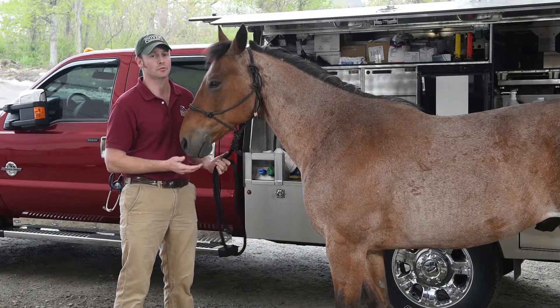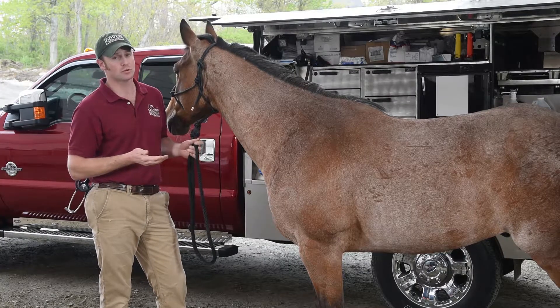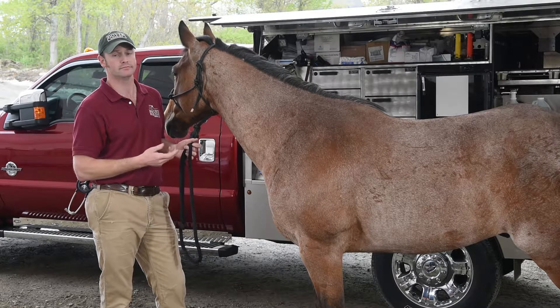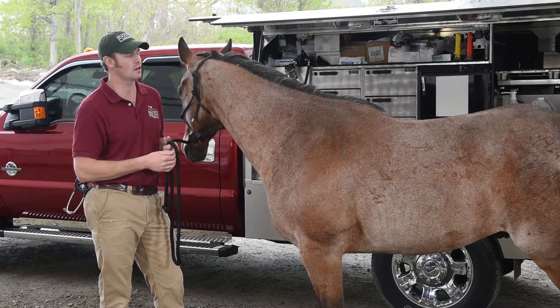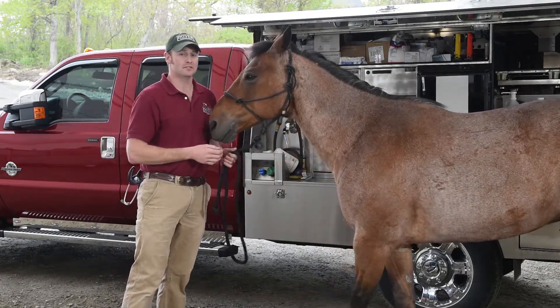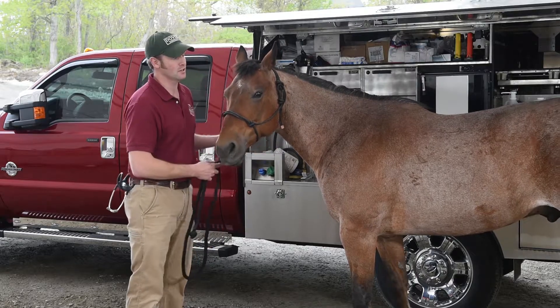Temperature is pretty self-explanatory. We get rectal temperatures in horses — don't be bashful with them. If you just put the little tiny metal tip in, you're not going to get an accurate reading. If you've ever seen a horse that's colicked, veterinarians are not bashful. We put on a big sleeve and it's a lot more invasive than that little thermometer, so don't worry about offending them too much.